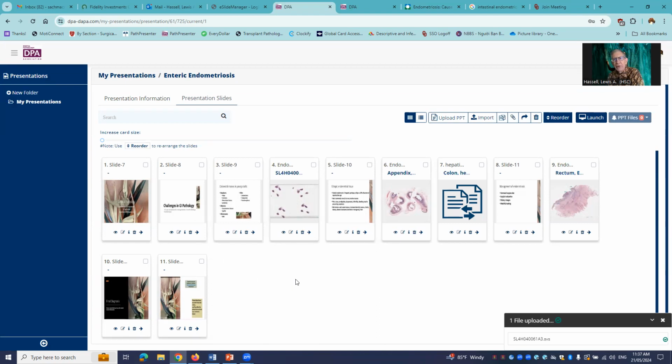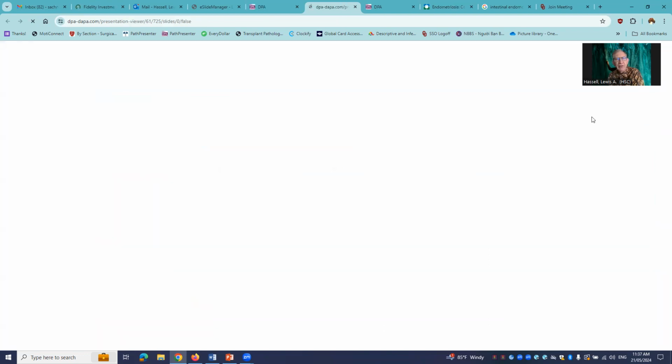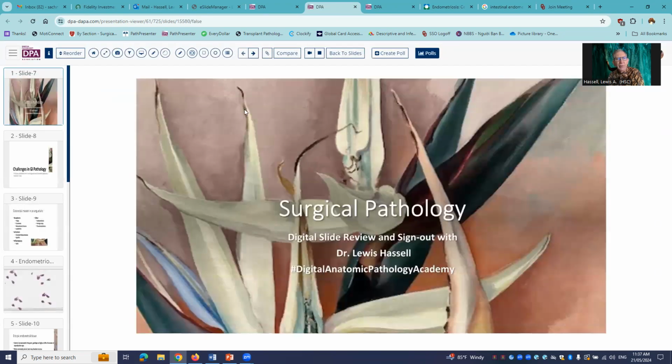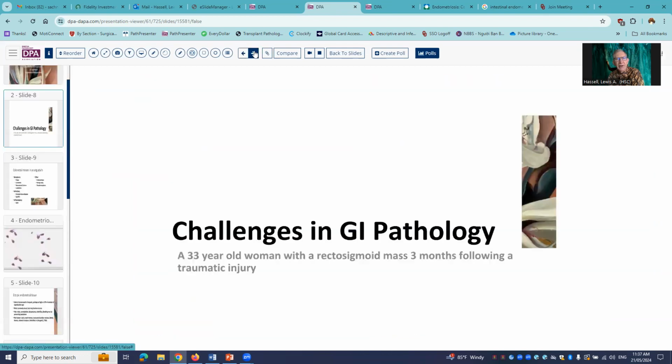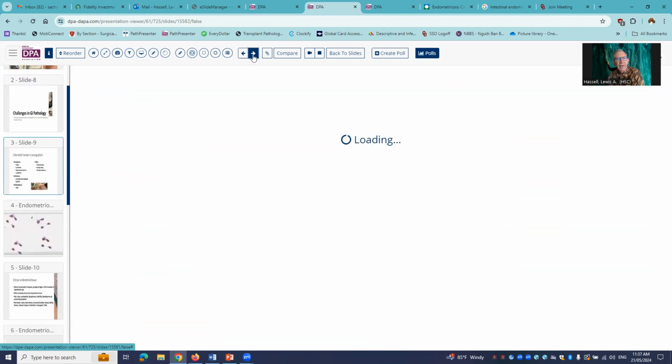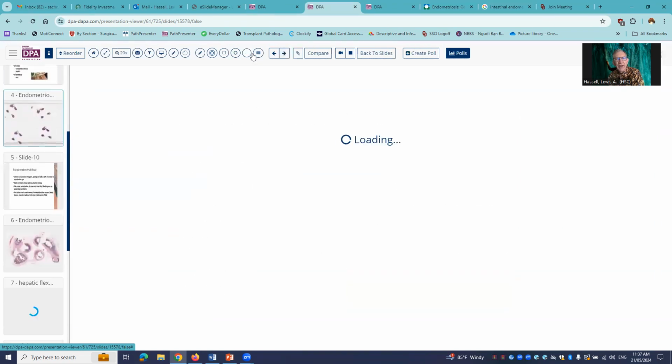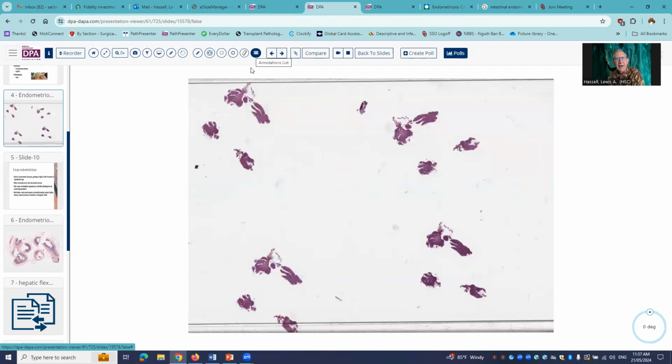Well, I think I want to test it out, so I can hit the launch version and just see if each slide is going to show what I want to do. So I'm testing it out. I see here's my title slide. I see my brief history, differential diagnosis, and here's my biopsy slide. That's the one I want.